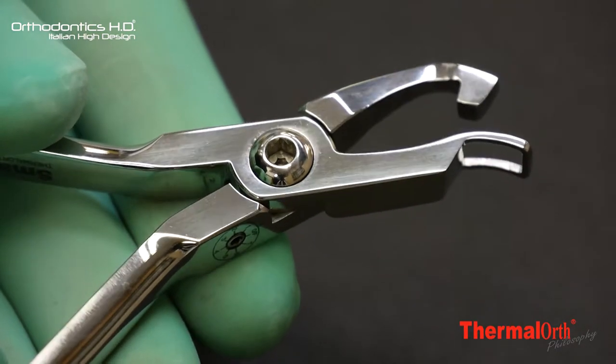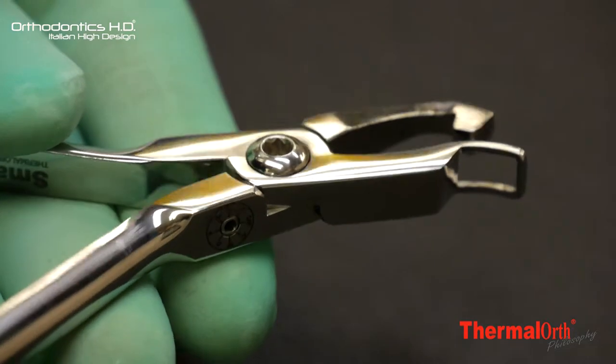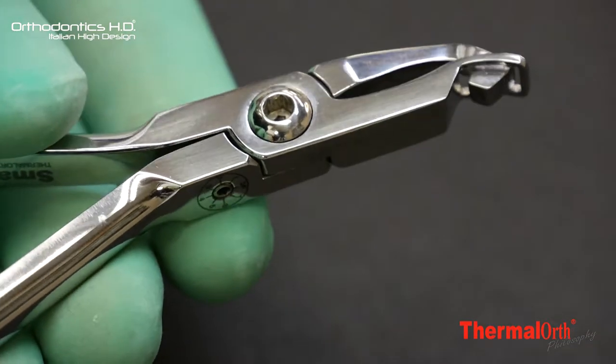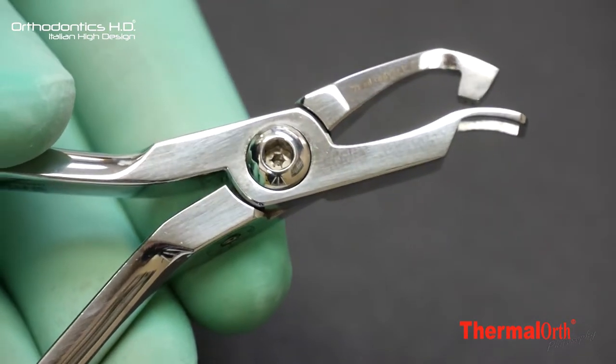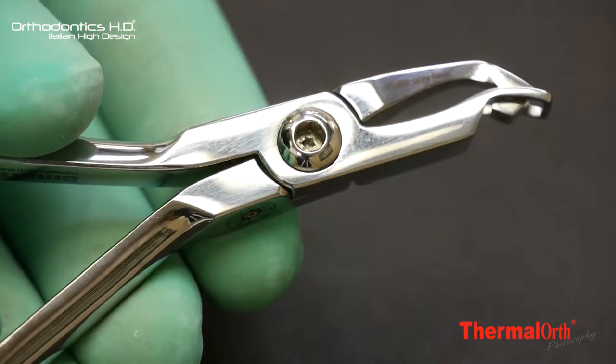the bite plane plier is the appropriate tool. The operator has a plier that instantly allows him to create a bump in the incisor back area with rapidity and precision.